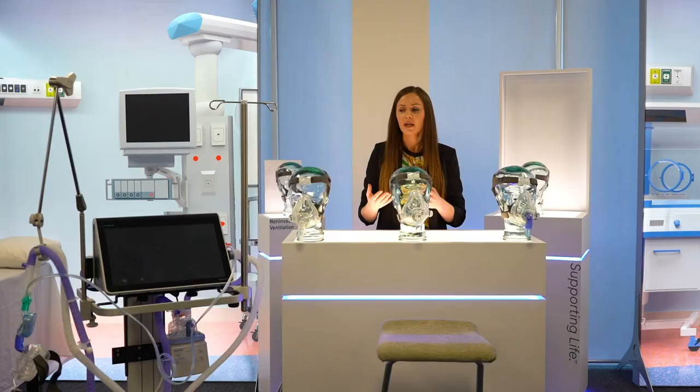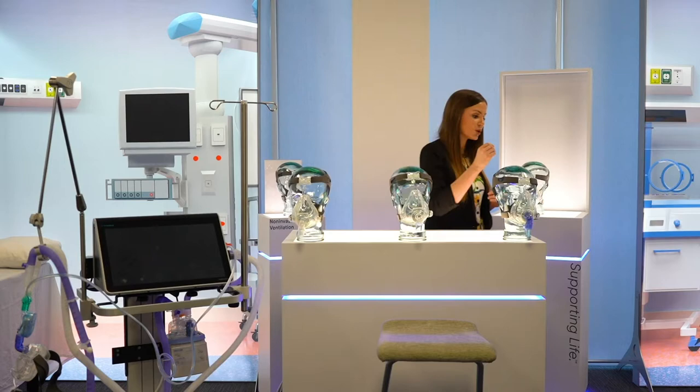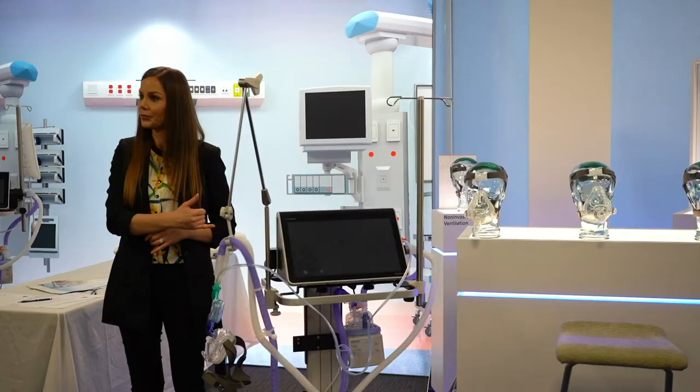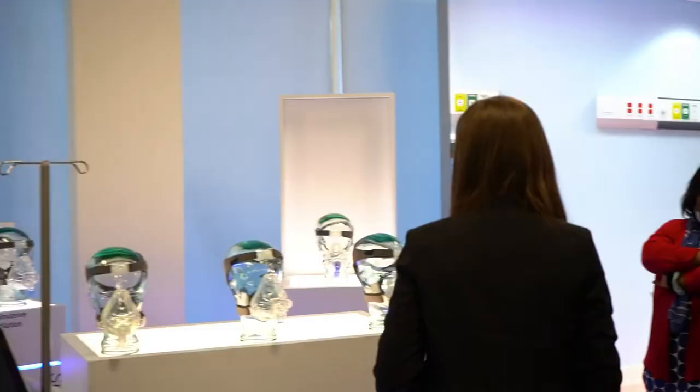If we think about a patient having invasive therapy, invasive would mean a tube down their throat. They'd be sedated, they would have an endotracheal tube. That tube would go into the mouth through the vocal cords, down the trachea to the windpipe, and that tube would then be connected to a circuit, like so, and that circuit would be connected to a ventilator. So non-invasive therapy is the opposite. It is a mask attached to the circuit, attached to the ventilator, okay? So that mask is providing breathing support for that patient.